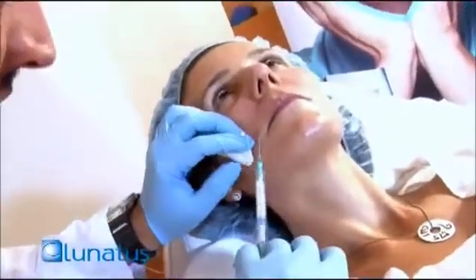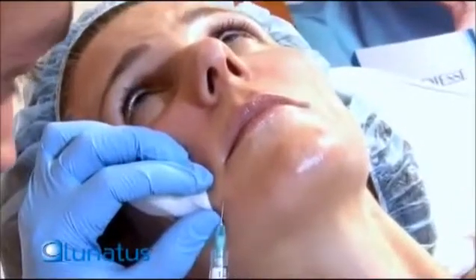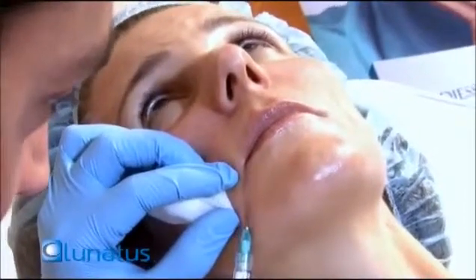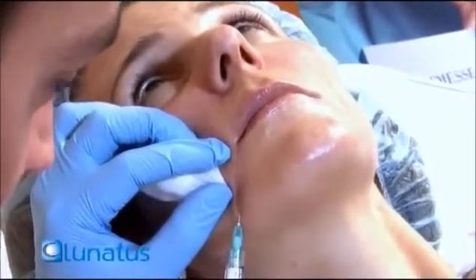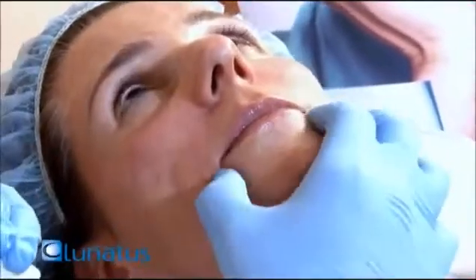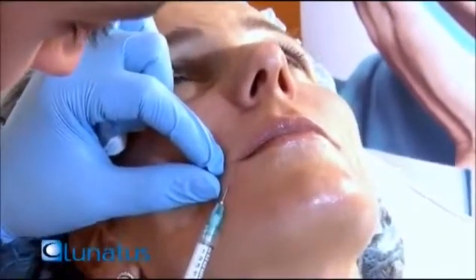I'm going to continue doing the same towards the marionettes. The insertion is going to be right here. I'll inject a little bit of the material as I'm coming out. We've injected just around 0.1ml of the material. She needs a little bit more — we're dealing just with the corners of the mouth. We are not injecting her lips.